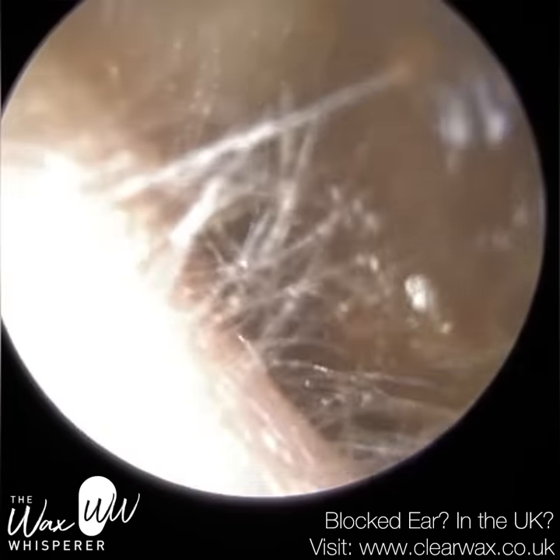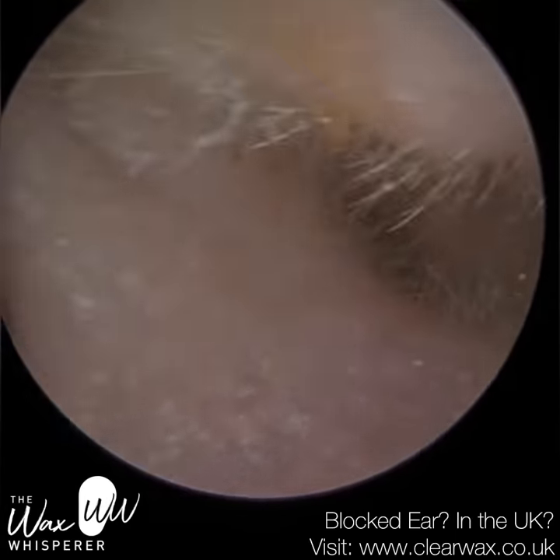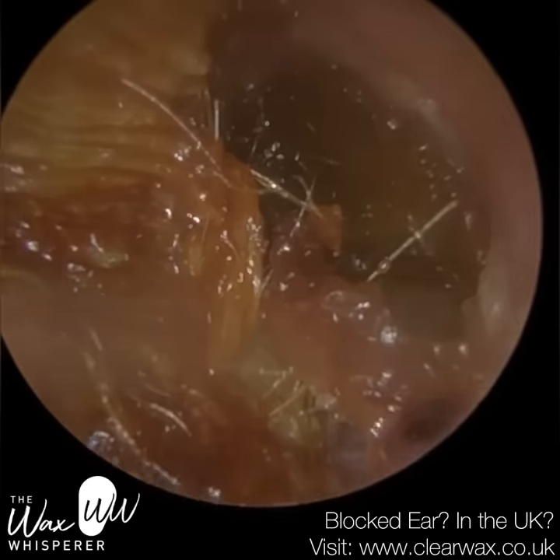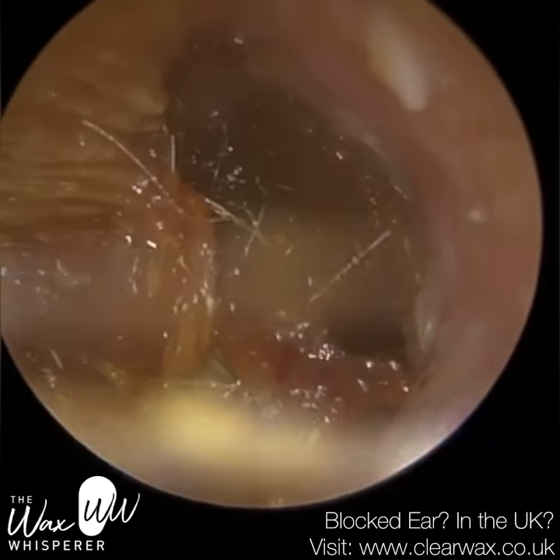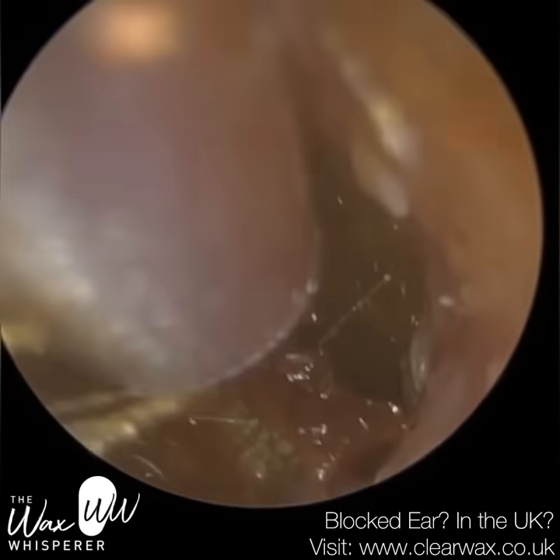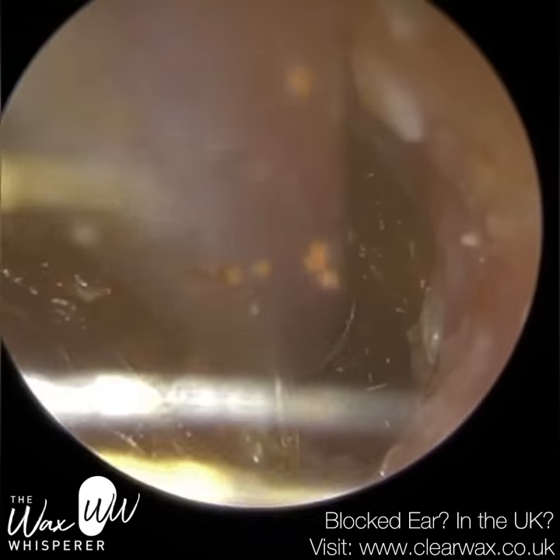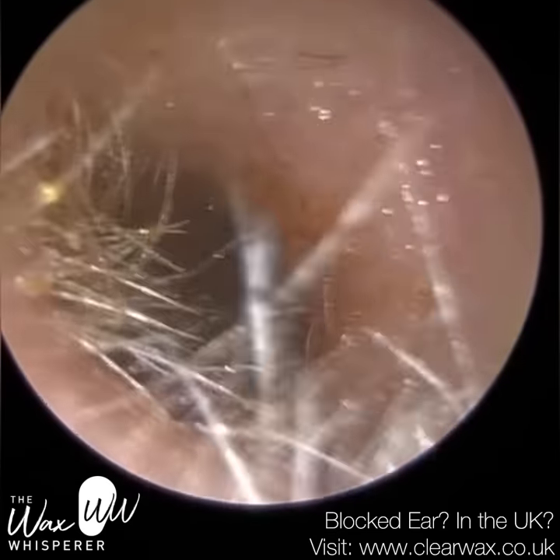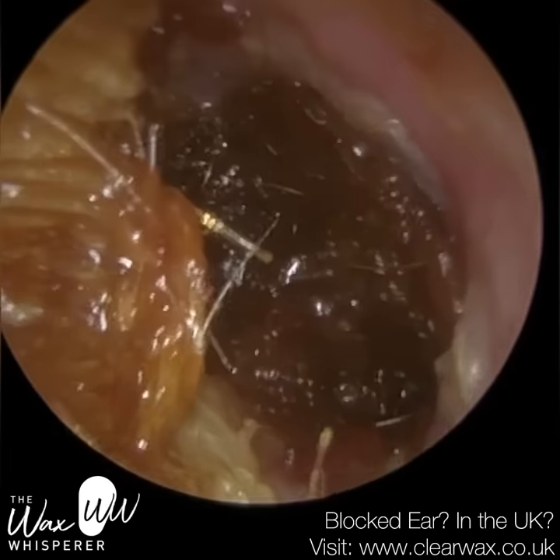They're in their 80s. And I've just brought that large plug of wax out there. So you've got a layer of skin halfway into the ear, and beyond that you can see the plug of wax which is up against the eardrum — so that's a bit tricky to remove. I think I'm reverting to the fine end suction probe here.